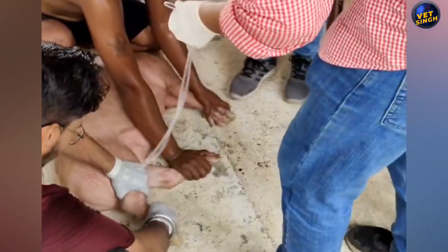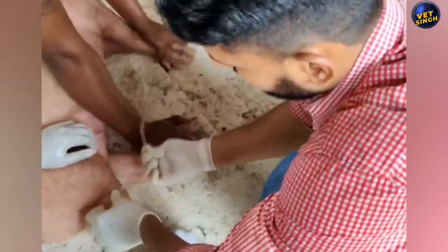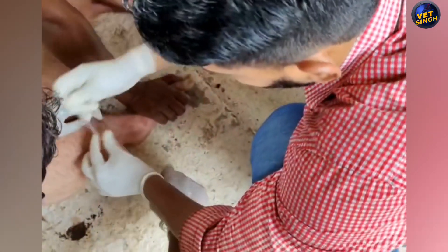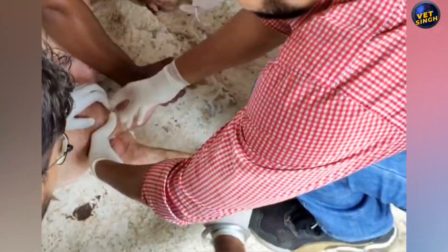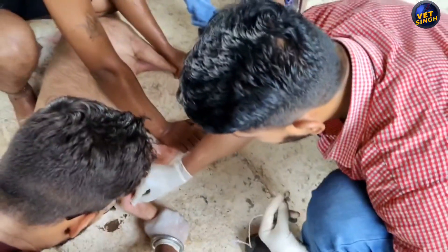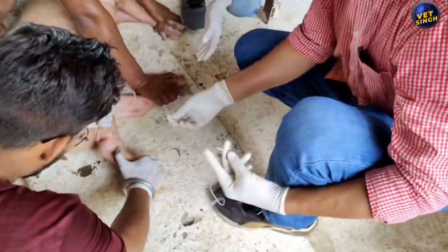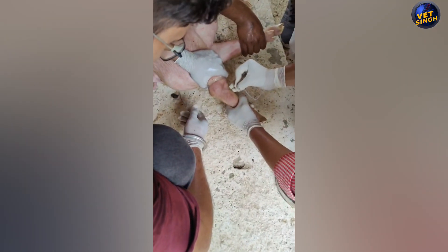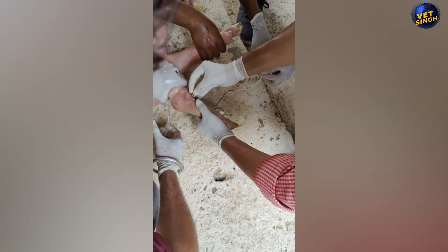Now you can all see: first we have to restrain the piglet with complete care. Then I apply the tourniquet to the right hind leg to completely restrain the leg and to pop up the recurrent tarsal vein. Then we apply a spirit gauze to make the area contamination-free.